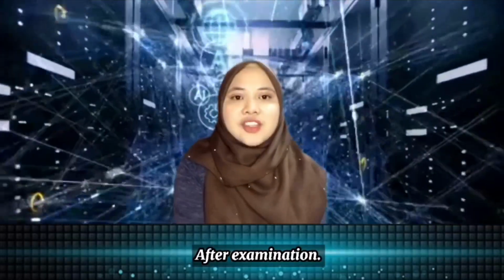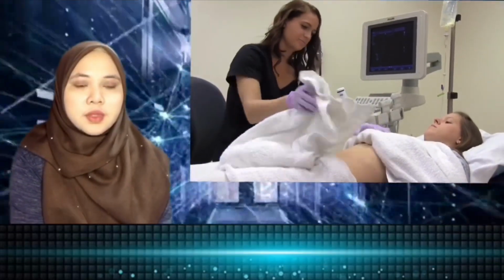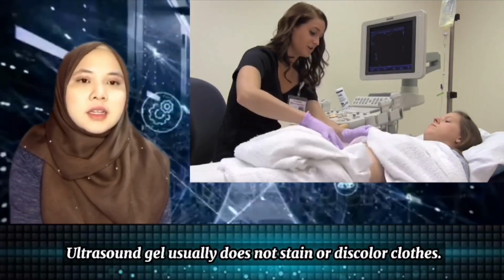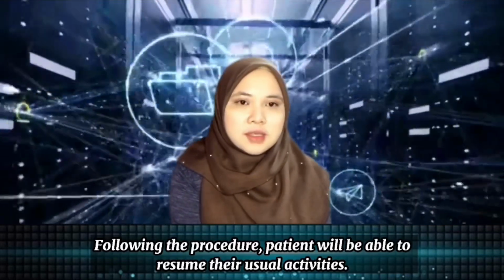After examinations, the gel will be wiped and cleansed from the skin after the procedure. Ultrasound gel usually does not stain or discolor clothes. Following the procedure, the patient will be able to resume their usual activities. That's all.